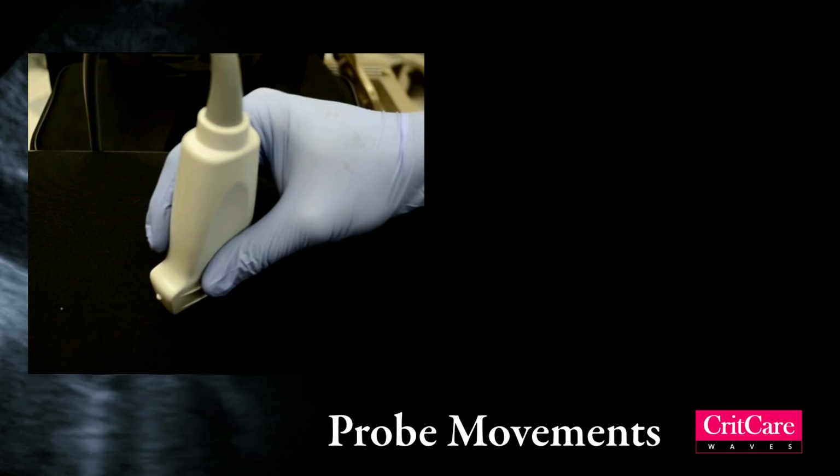Let's go on to the different planes of manipulation of an ultrasound probe. These movements are important to know for a couple of reasons. One, we will be using these to obtain and optimize our images while scanning. And two, for me to teach without touching the probe, this communication of movements is extremely important.